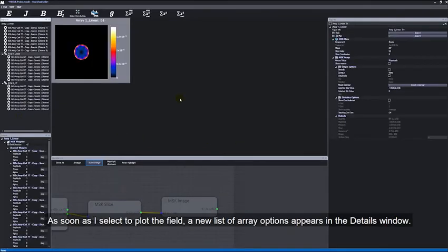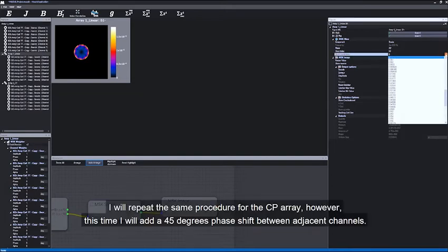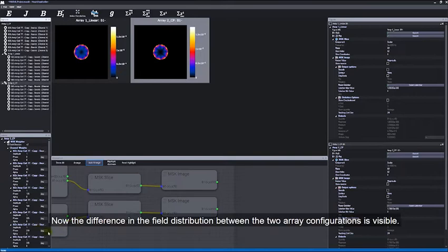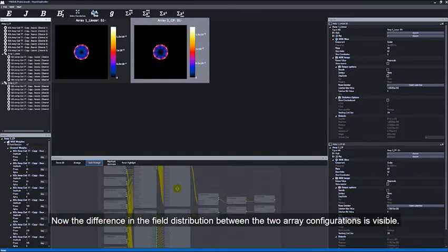As soon as I select to plot the field, a new list of array options appears in the details window. I will repeat the same procedure for the CP array. However, this time, I will add a 45 degrees phase shift between adjacent channels. Now the difference in the field distribution between the two array configurations is visible.